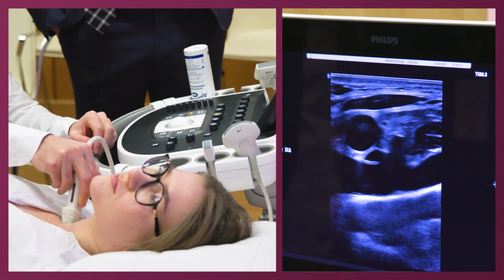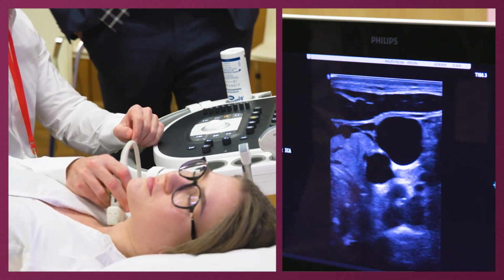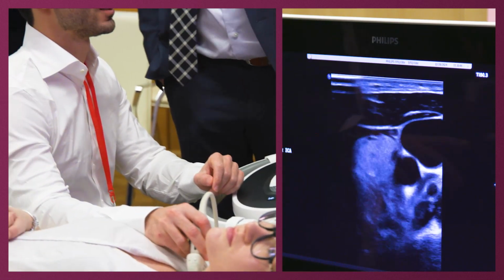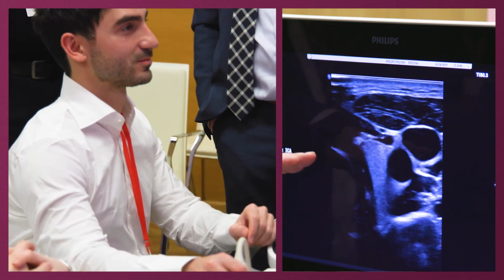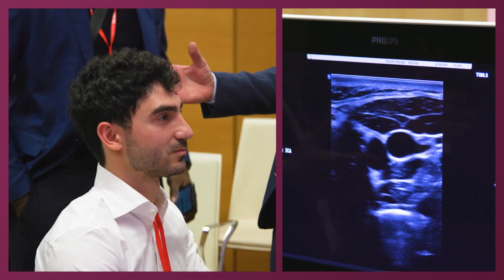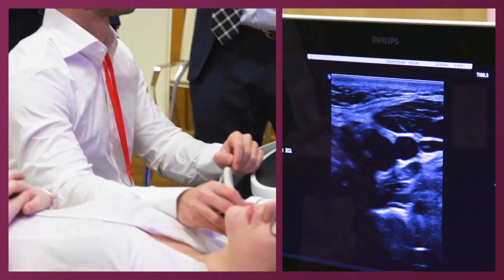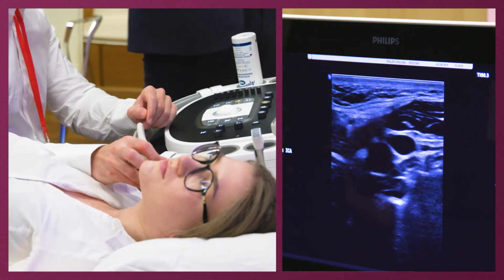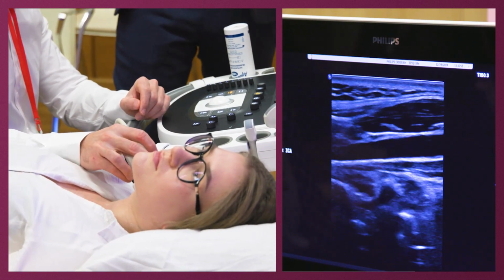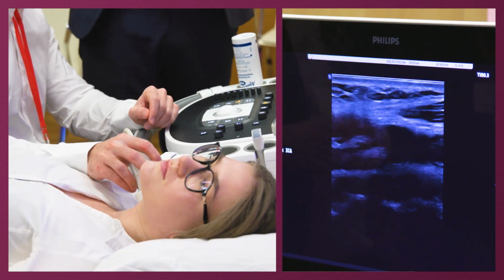Now you're cheating, showing us the subclavian. So the vein, just compress it. Exactly. I think in general you should not. You do the compression of the vein just to be sure that you are in the right place, but it's not very nice for the patient to be compressed. So I think it's a good guide not to compress too much. It should be open. If you're in trouble, it's because you lack gel.